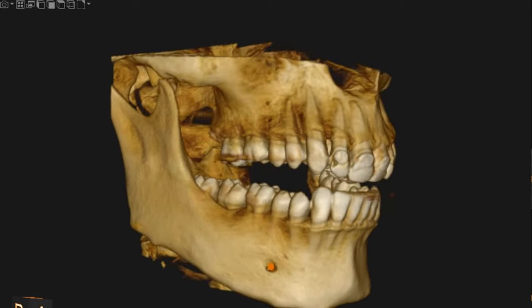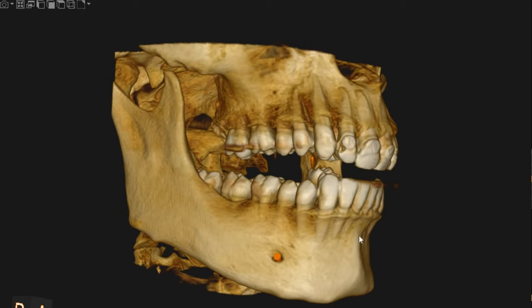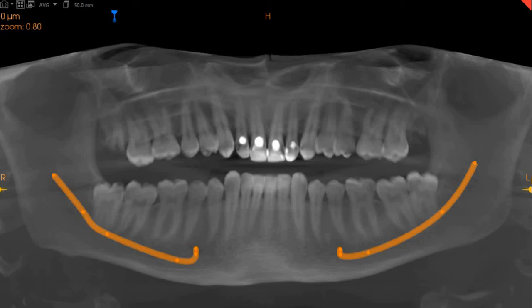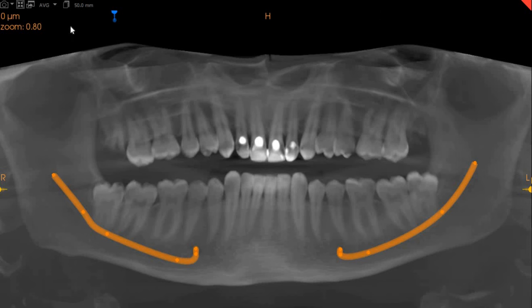Hello and welcome to Ultrascan Diagnostics. The area of interest is all four wisdom teeth for evaluation. I will start with the top right.